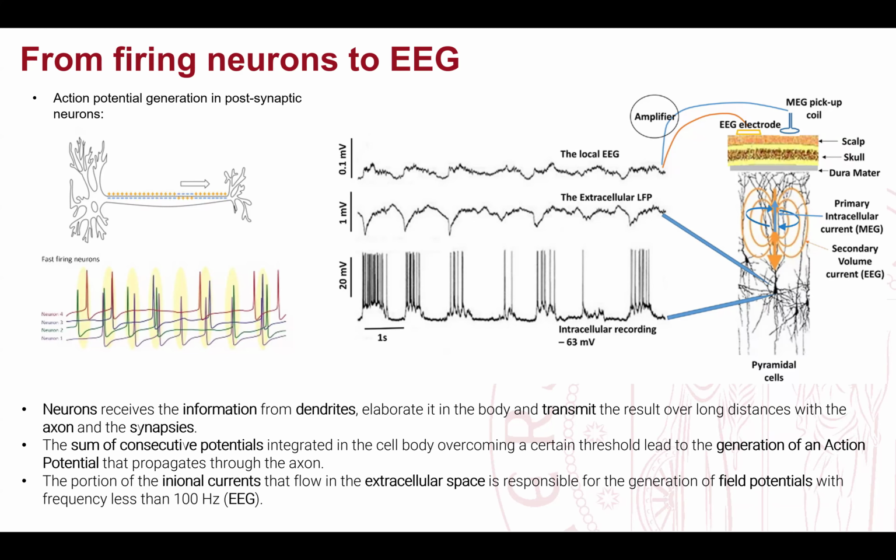This noisy information is still very important. But we have to be aware that what we are really measuring is not the electrical activity exactly related to the spiking of the neurons, but what remains of what is not transmitted in this signal. So it is again the noise.